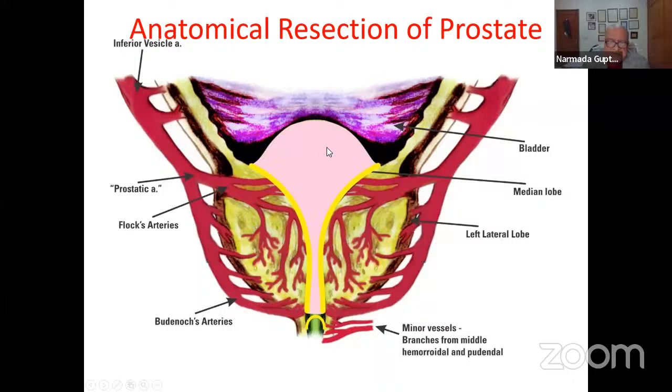So in this, what I do is start at 5 or 7 o'clock and make this groove, which you have seen Mallikarjun nicely demonstrate. Then the median lobe becomes avascular, and you can resect fast. We want to complete the job in 1 hour. We don't want to continue for even a 150, 100 or 200 gram prostate. So first we make the groove and resect the median lobe.